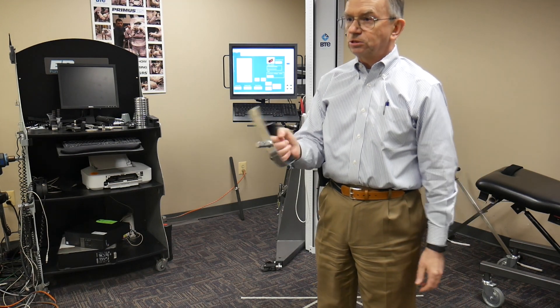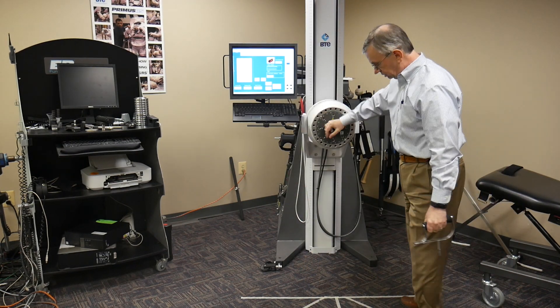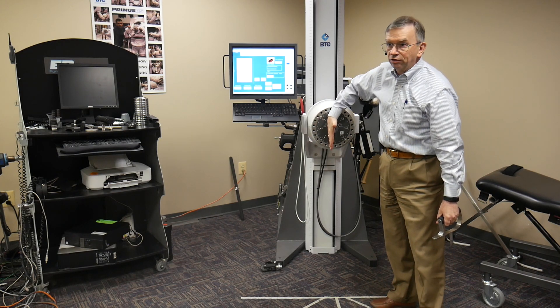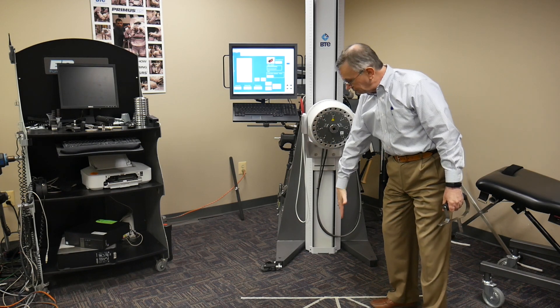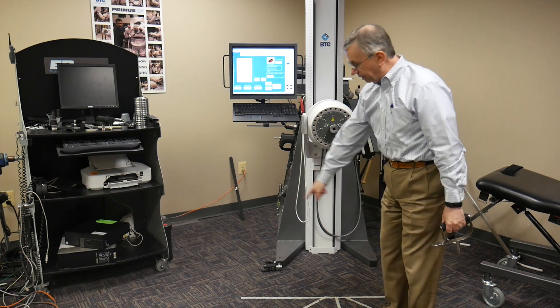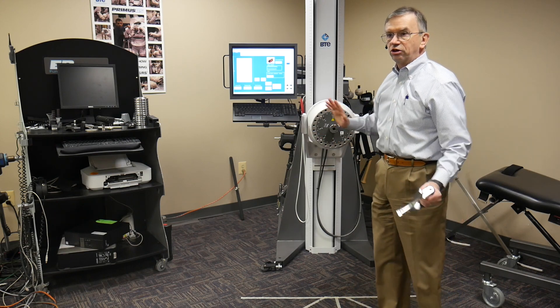Just doing simple things like supination and pronation with the 601 — this stripe that's right down the middle is lined up right with the middle of the shaft, and it's right below it, and it just comes out about three feet. That one is going to be the most useful line. If you don't want to put all of these, if you at least put that center line, it's going to help a lot.